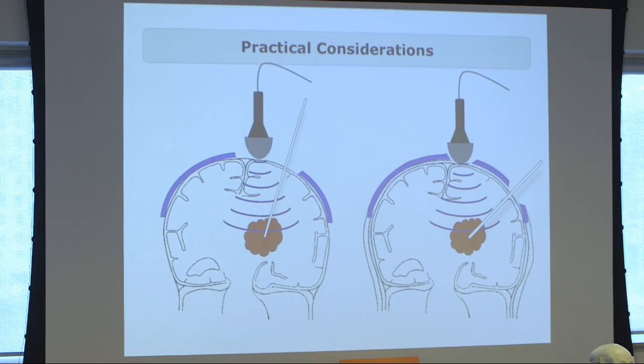Now, when you're taking a biopsy, you have two options. You can have a larger trephination and then go parallel to your ultrasound probe, or you can have a second burr hole trephination in a different position. Ideal would be a 90-degree angle, but that's not always very easy to get done. But say a 45-degree angle would be sufficient, and you've got a second window through which you can watch whatever you're doing with your biopsy cannula.